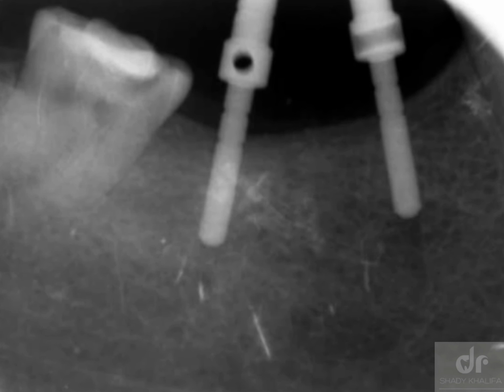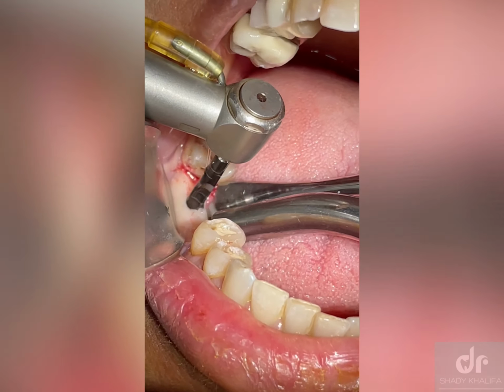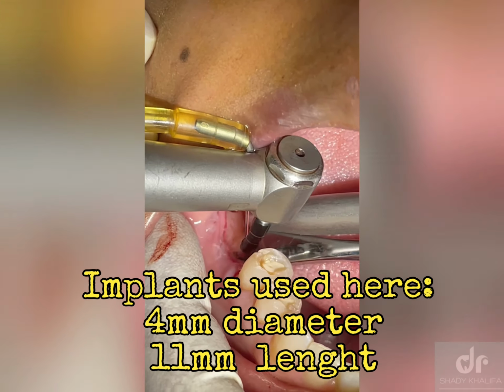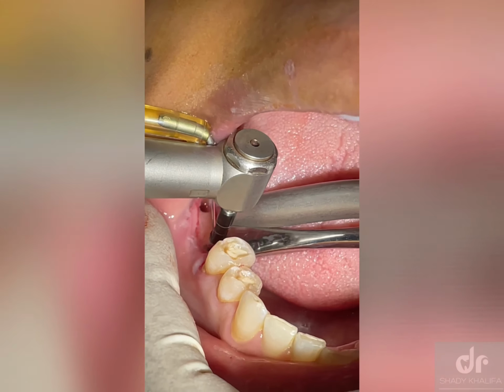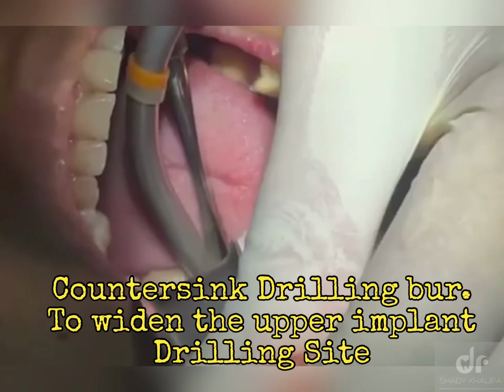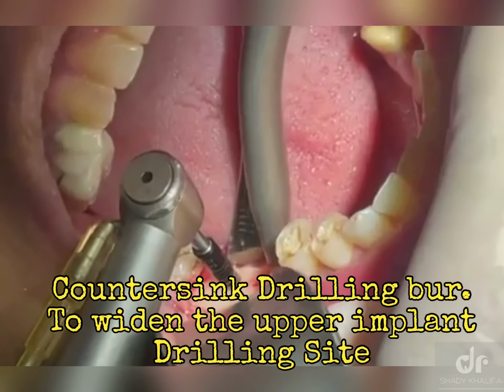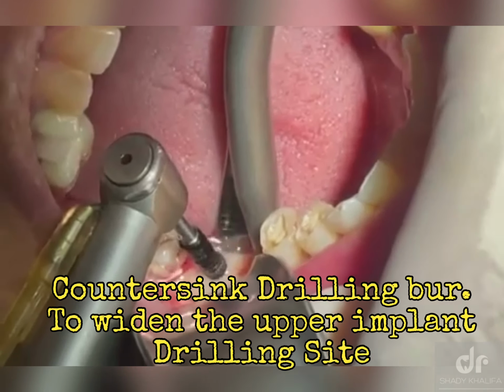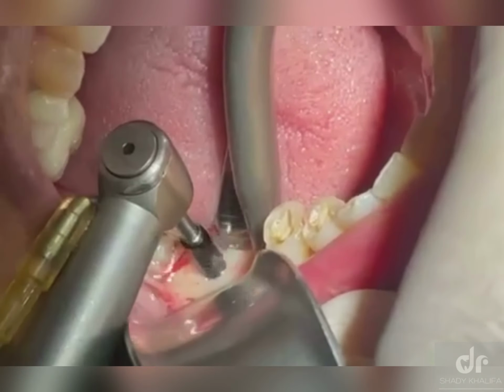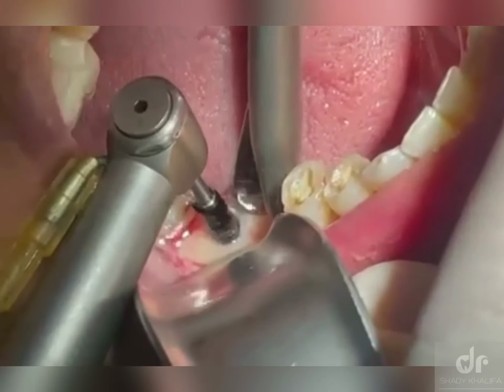Then we start gradually, according to the manufacturer or the company of the system, step by step. And after that, there is something very important that I want to mention. This is called the countersink. This is the widening of the coronal side, or the crest, the upper part of the implant site.